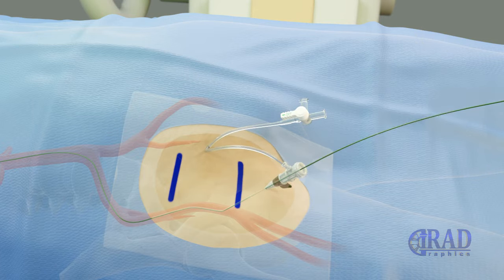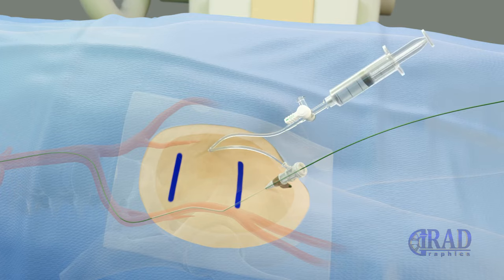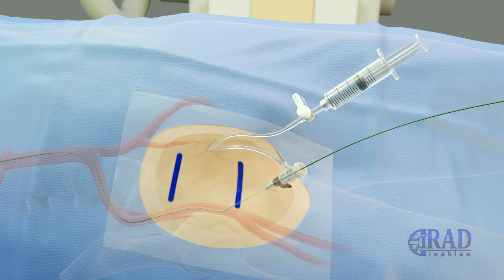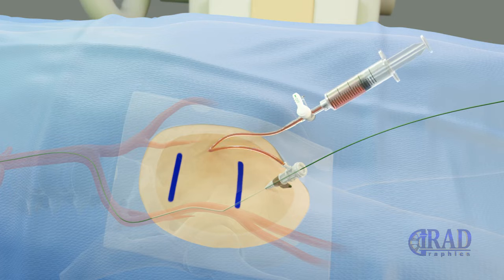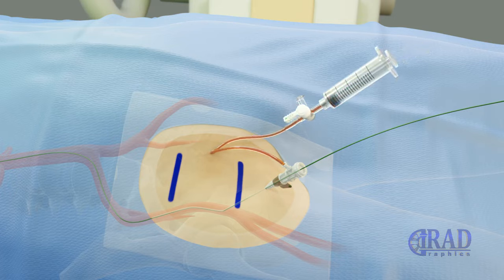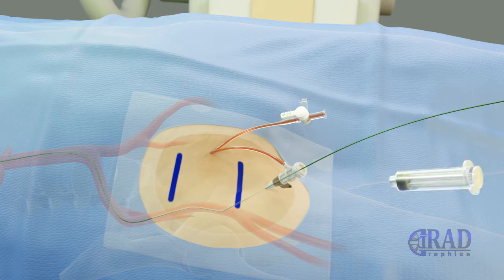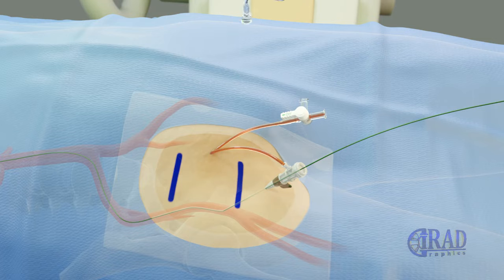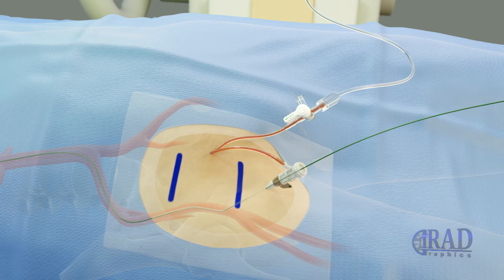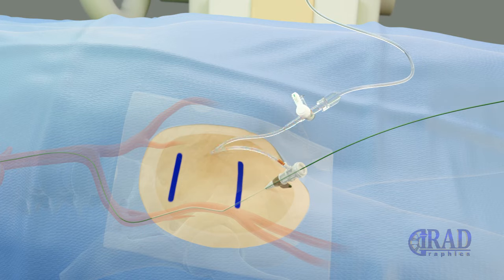The dilator of the vascular sheath is removed. At this point, the sheath is aspirated and flushed with heparinized normal saline. Depending on the situation, contrast may be injected to assess the patency of the common femoral artery and safety of the access. Then, infusion of normal saline is started through the sheath to avoid possible clot formation at the tip of the sheath.